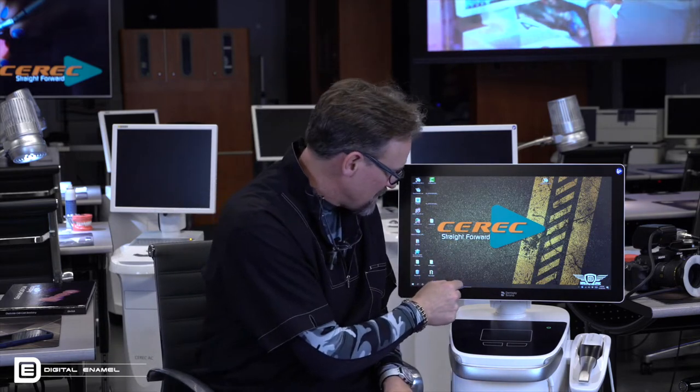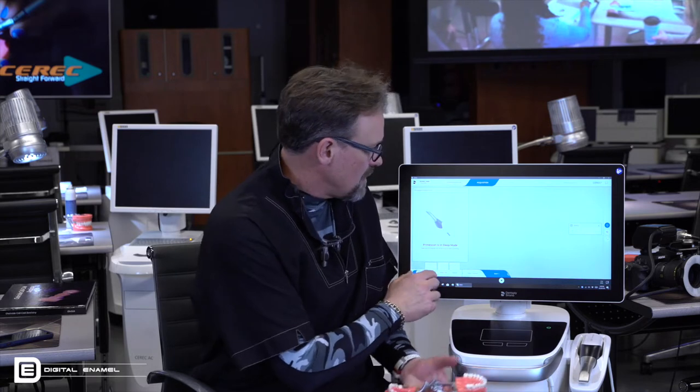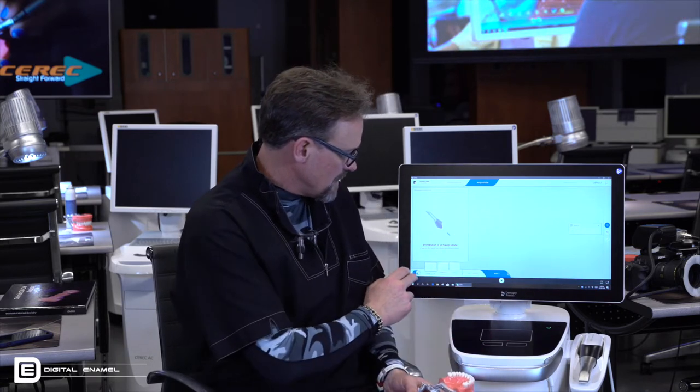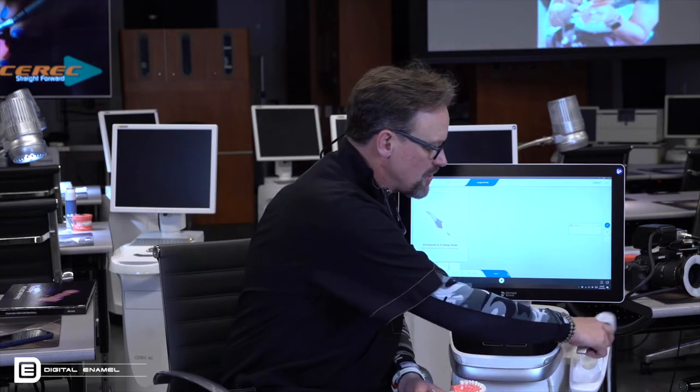So we'll open CEREC here. Let me get a model. All right, so we're gonna image a prep on number 30. First thing is, camera will automatically turn on when we grab it.